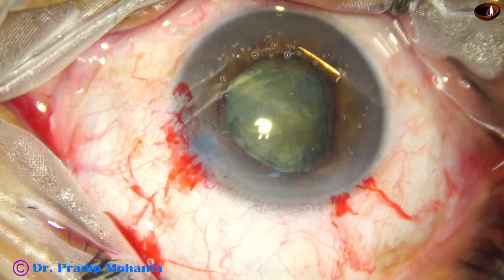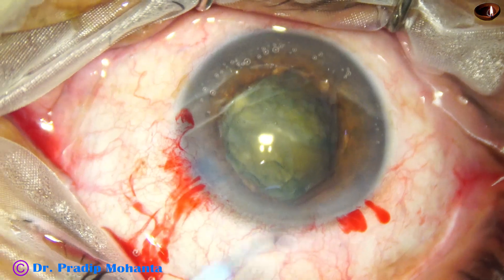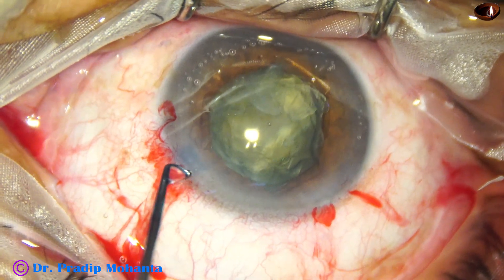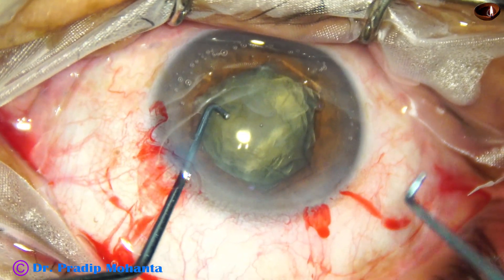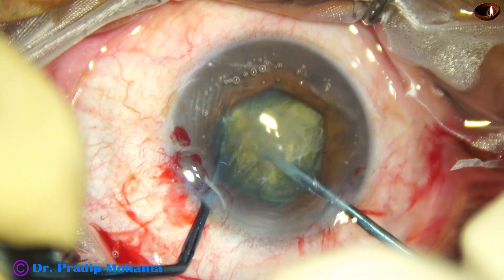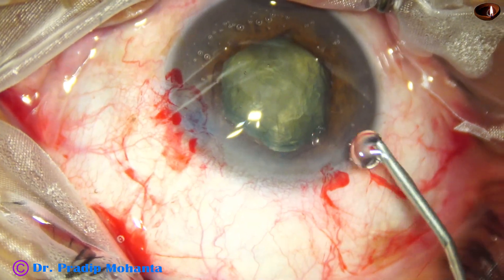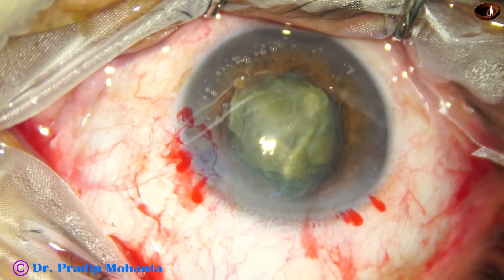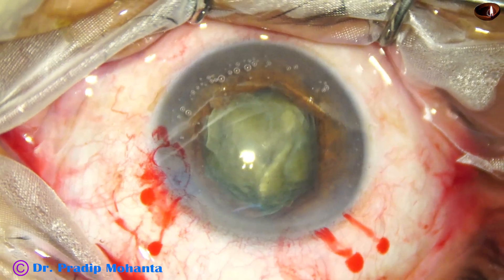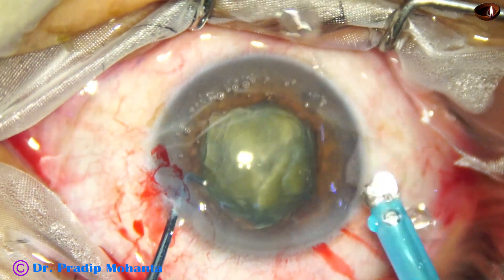I have divided the nucleus into 2 hemi-nuclei. The anterior chamber is shallow, so I come out, inject visco, take a small hook, rotate the nucleus — orienting it so that I can pre-chop one hemi-nucleus. This hemi-nucleus is pre-chopped. Management of this nucleus is very easy, and pre-chopping is just a matter of doing some cases — not a long learning curve. If you do just 5-6 cases, you are done.